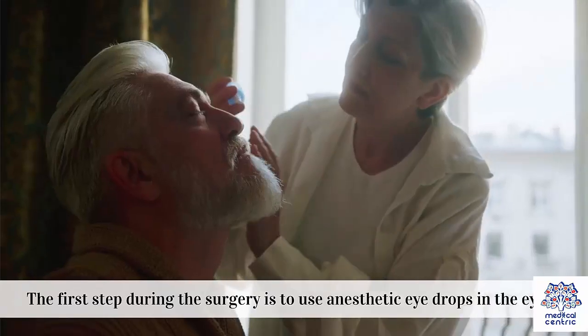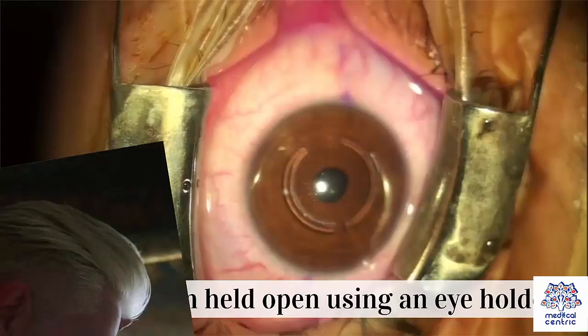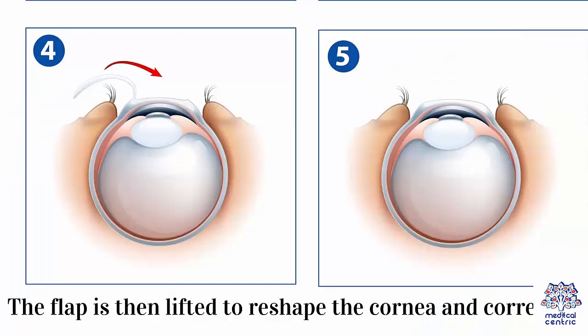The procedure: The first step during the surgery is to use anesthetic eye drops in the eyes. The eye is then held open using an eye holder. A flap is consequently made on the outer layer of the cornea using a laser or a small blade to make an incision. The flap is then lifted to reshape the cornea and correct it.